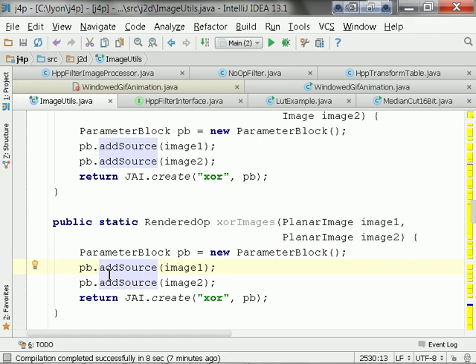Got that? My question was, can you use pseudo-color on the image before you start windowing it, or do you window it and then apply the pseudo-color? I think you have two different results. You could pseudo-color the image first, then create the animated GIF. But if you pseudo-color the image, you're going to have more than 256 colors. So after you pseudo-color the image you'll need to requantize the image, and then create the animated GIF.